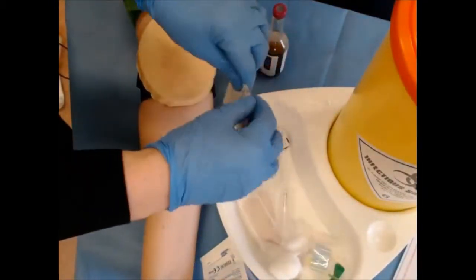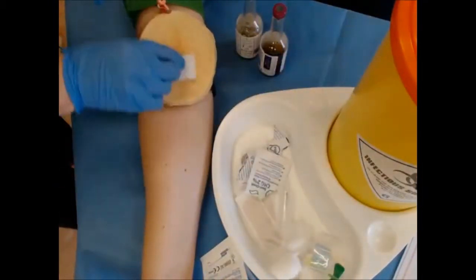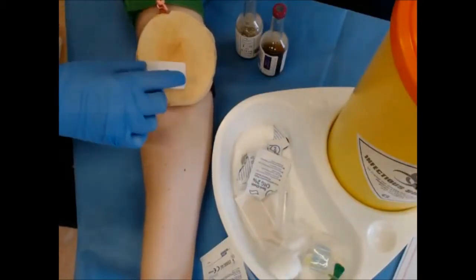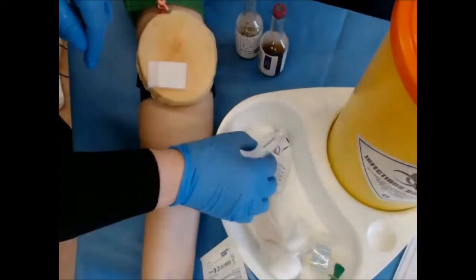Then take your second chlorhexidine wipe and clean your patient. And allow the alcohol to dry on the skin.